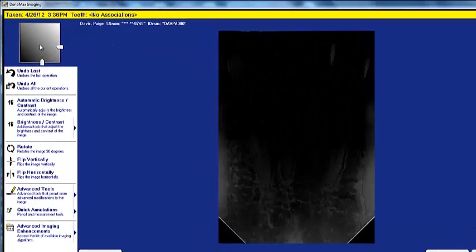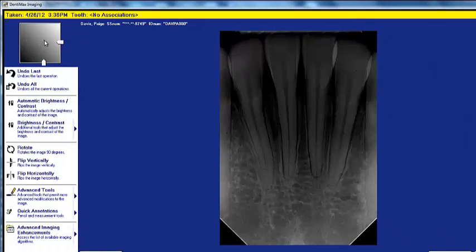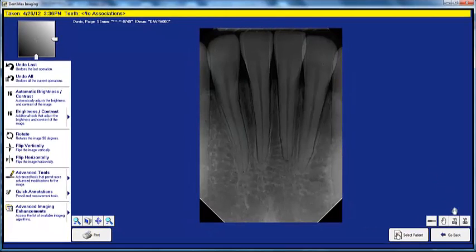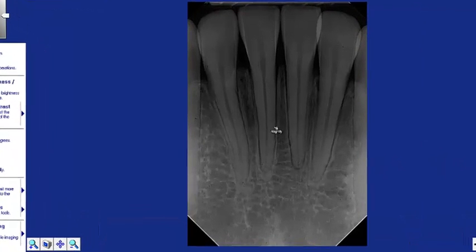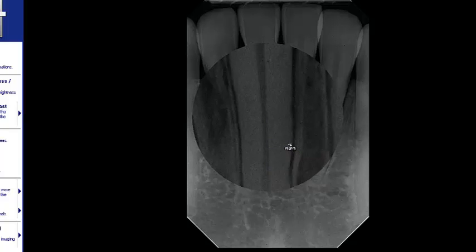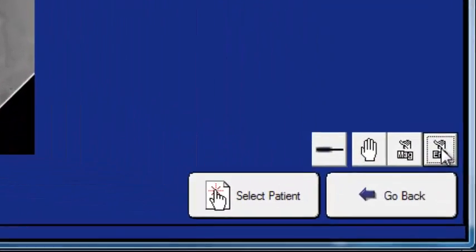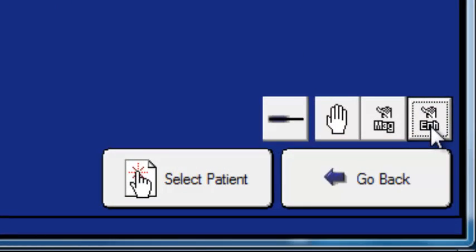Here we are looking at the grayscale box. If the image isn't dark enough, we can use our mouse to make it darker or lighter — a very easy-to-use tool. Another tool that dentists commonly use is the Magnification tool. Click on the Magnifying button in the bottom right-hand corner of your screen, then click on the tooth and right-click. It really zooms into the x-ray — you can view the root canal very clearly.